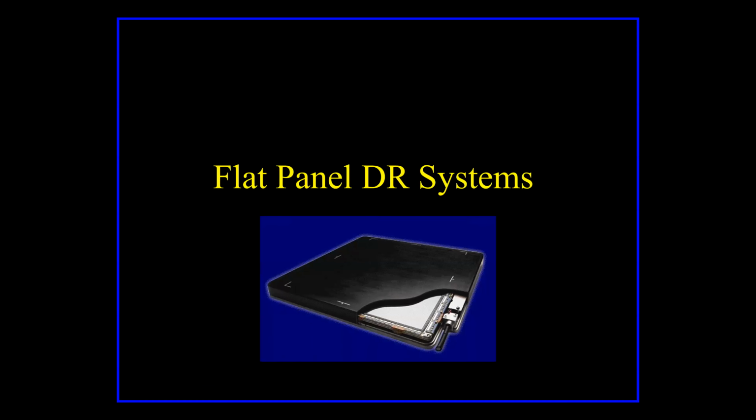So this is a picture of a DR plate. Okay, so it's a big plate. It's got fancy electronics inside of it. And the cool thing about the DR plate is once I expose that patient and I press the button for the exposure, instead of having to wait 30 or 60 or 90 seconds for that image to show up on the computer screen, with DR systems it shows up in 2 to 3 seconds.